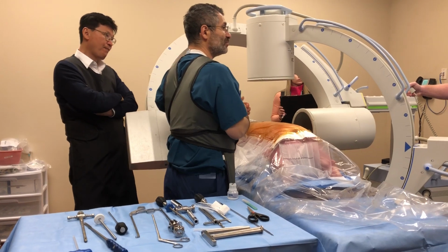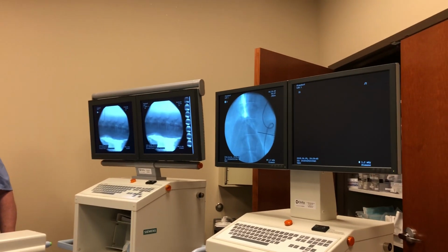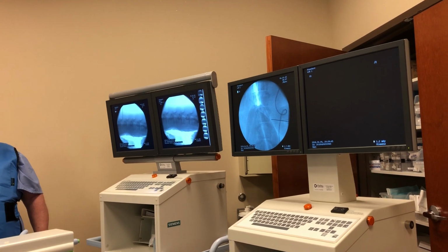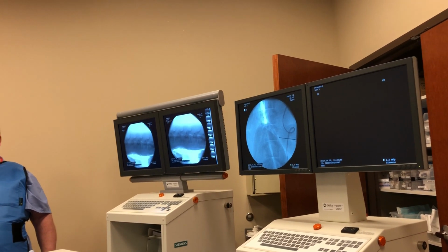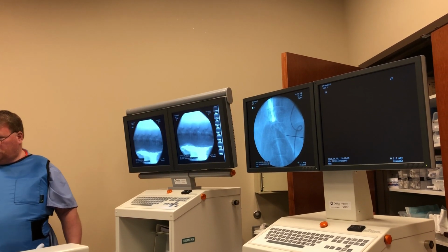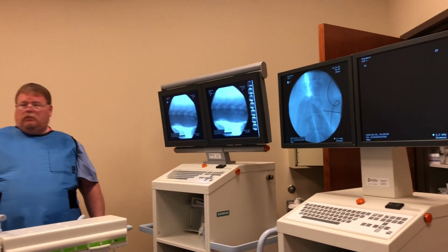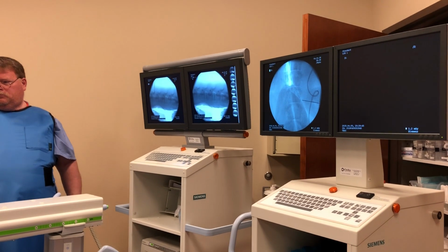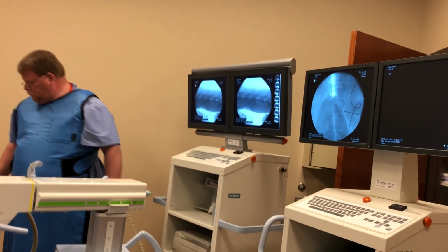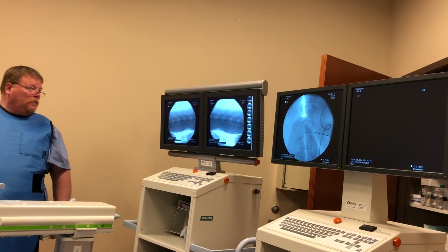So is that a new lateral? Nope. Is this a new lateral? There's your new lateral. Is that a new lateral? Yep. So I still need to go lower, huh? Okay. Because I want to go after that one. X-ray? Is that too much, huh? No. Maybe we could get a lateral. That cannot jump so much. Again. Oh, we are switched. We are top down, up down. Switch them back and forth, please. Okay, now it makes sense.